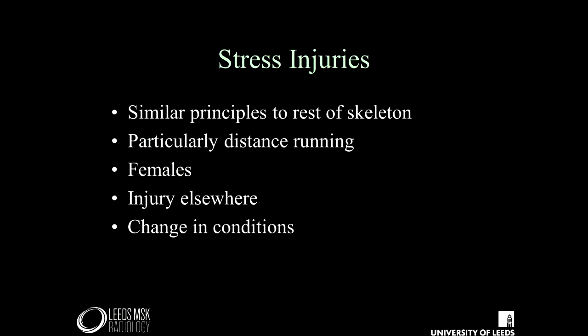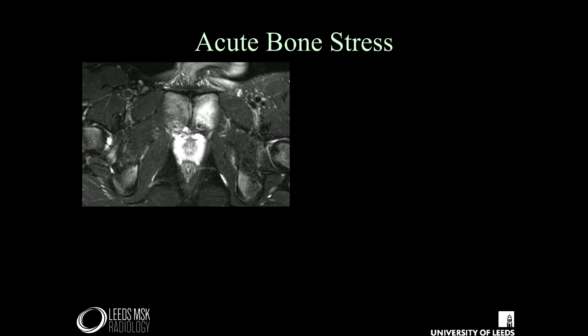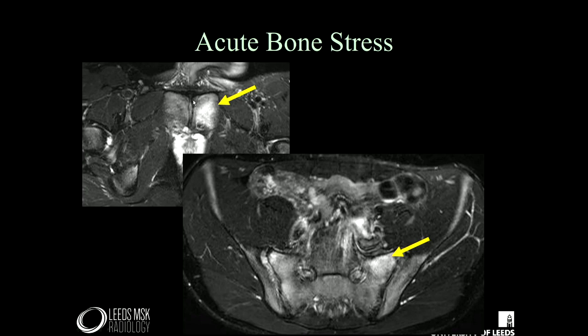Looking at acute injury: stress injuries through this region follow similar principles to the rest of the skeleton, usually in runners or athletes. Females are more predisposed because of the lack of muscular bulk surrounding the area. Injuries elsewhere can precipitate a change in training that then precipitates the stress injury. In this young 16-year-old footballer, there's quite marked edema in the left pubis compared to the right. In the remainder of his pelvis, there's corresponding stress in the SI joint — so this is a stress through the pelvis generally. The prognosis is excellent with rest and alteration in training.